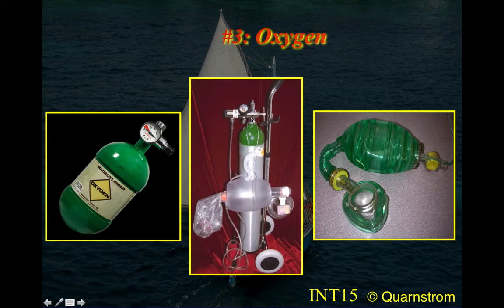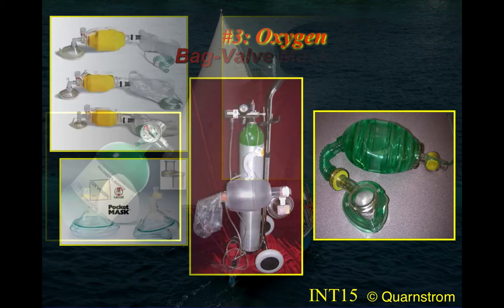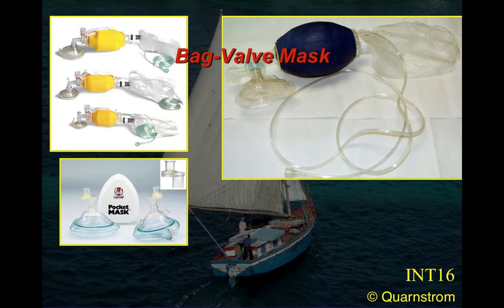The small tank we have in the office, I've been watching now for 10 years, and its pressure is as high as it ever was, other than the fact that I turn it on every year when we do our emergency training to show people how to turn it on, but it's still 95% full. And they come with a gauge that tells you how much pressure is in these tanks. But you need one of these. It's very important. The bag valve and mask has changed. The old Ambu bag was made of rubber, and it sat under the sink in one of your operatories for 35 years.